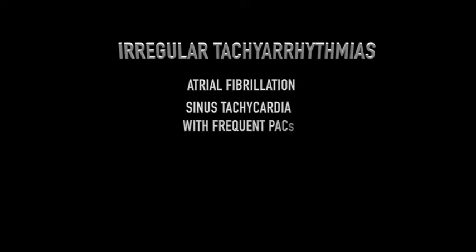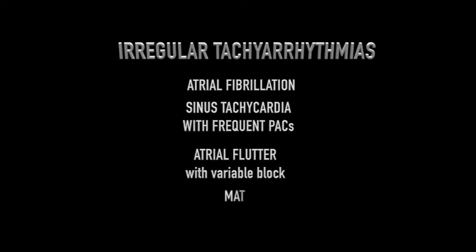What happens if we get an electrocardiogram where the ventricular response is irregular? We then can narrow the differential down to 4 distinct possibilities. 1, atrial fibrillation. 2, sinus tach with PACs. 3, atrial flutter with variable block. And 4, multifocal atrial tachycardia.